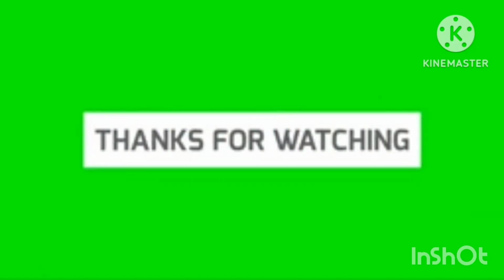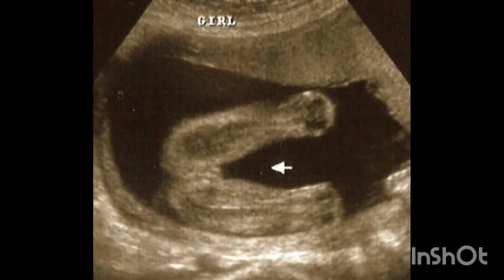Hello everyone. This is ultrasound made easy. Now we will be looking at baby girl sex at 20 weeks of pregnancy.